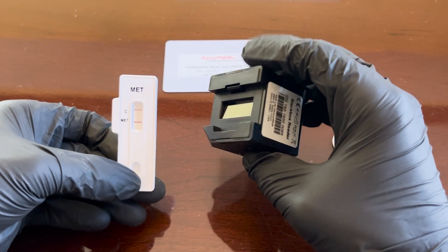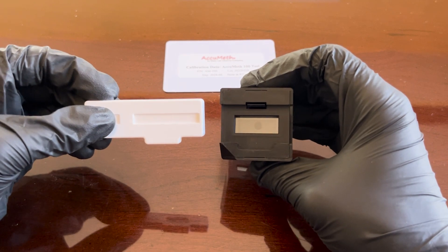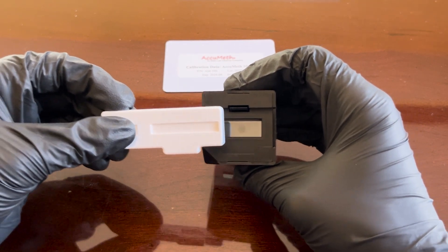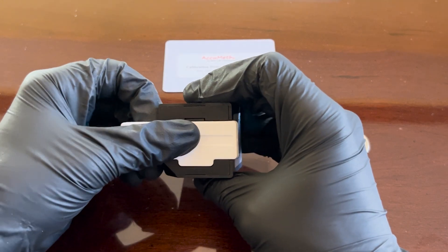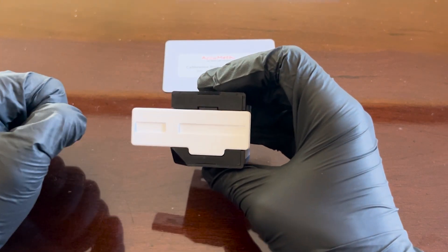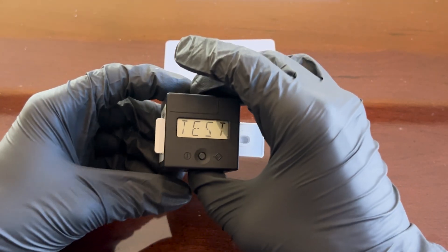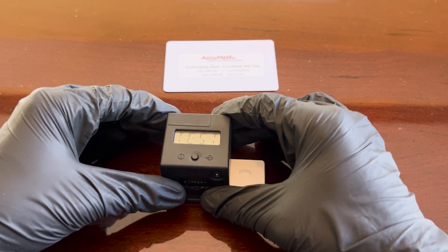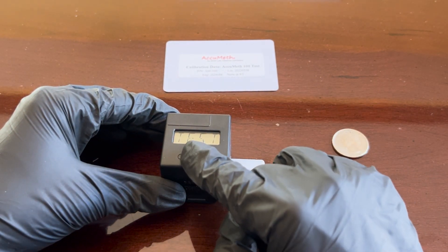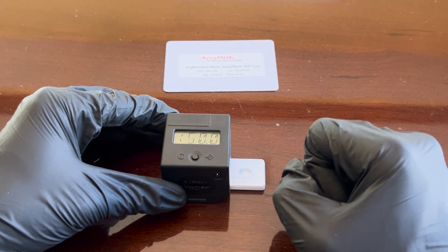On the bottom of the black box device you should see the glass that the device looks through to read our test. We're going to place our cassette in the cavity of the bottom of the black box — it should fit snug, just like a piece in a jigsaw puzzle. Place your black box reader and test cassette on a level horizontal surface and press the central button to run the measurement. The display will show the word 'run' until it returns results.